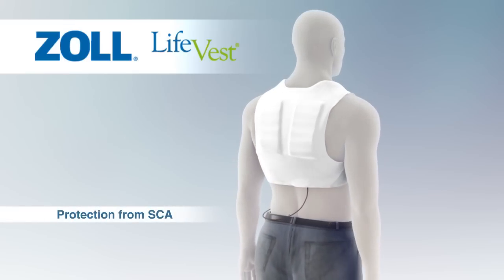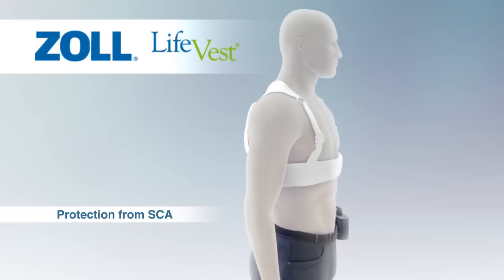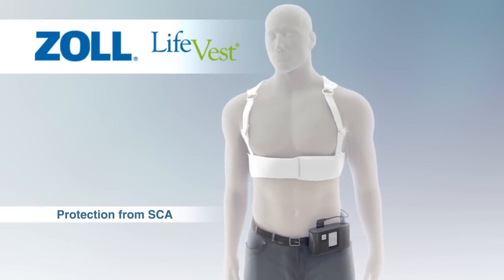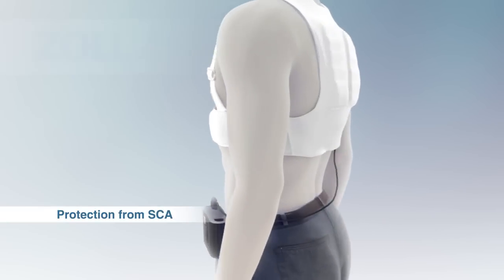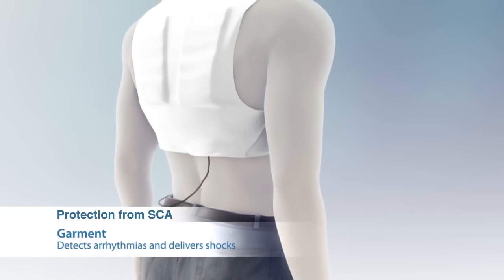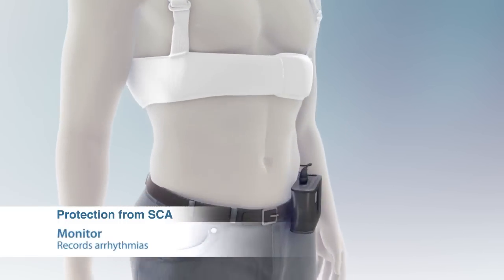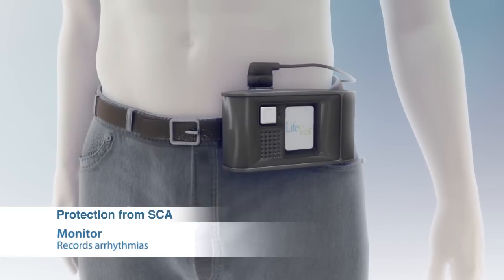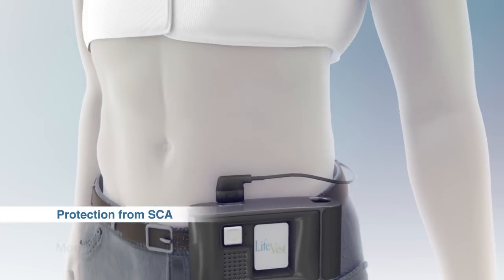Unlike an implantable cardioverter defibrillator, the LifeVest is non-invasive and is worn outside the body rather than implanted inside the chest. The LifeVest consists of two main components, a garment and a monitor. The garment is worn under clothing. It detects arrhythmias and can deliver treatment shocks to the heart when necessary. The monitor is worn around the waist or from a shoulder strap. It monitors the heart, records arrhythmias, and determines when treatment is required.